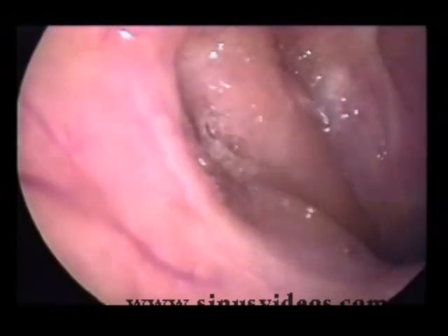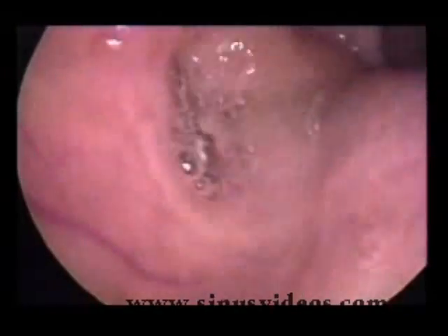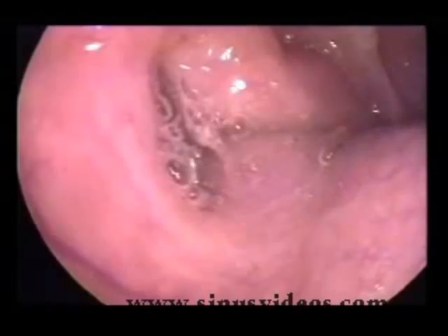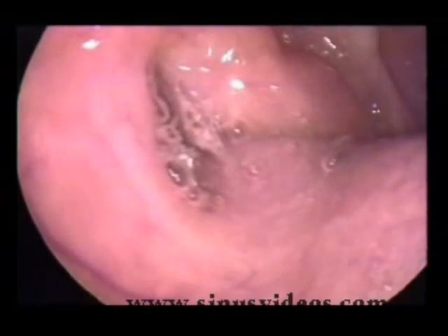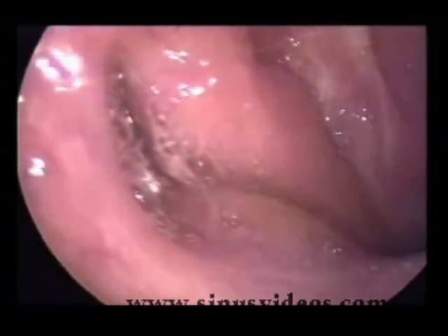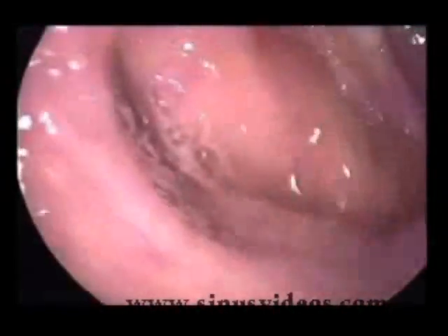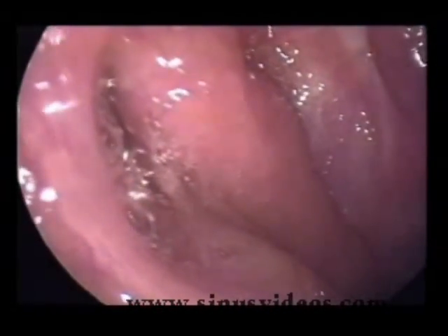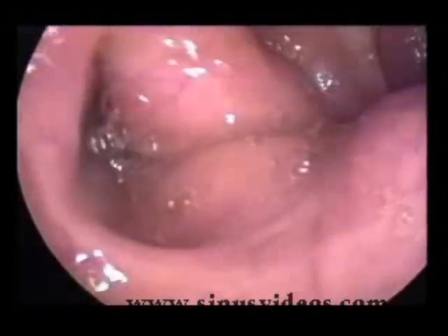This is a patient with typically normal eustachian tube function who now has an upper respiratory infection and otitis media with effusion. Note the diffuse edema and excessive mucus, but there is excellent muscular function in the levator and tensor.